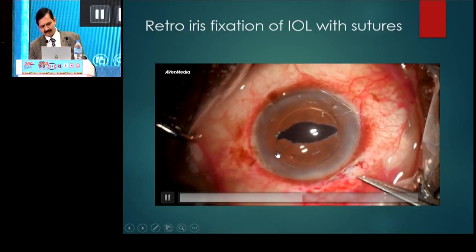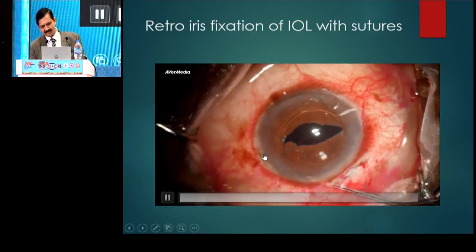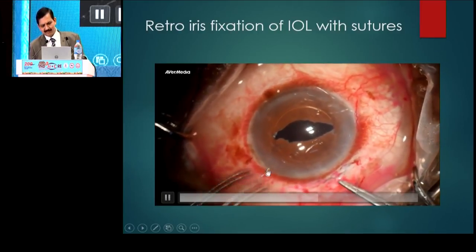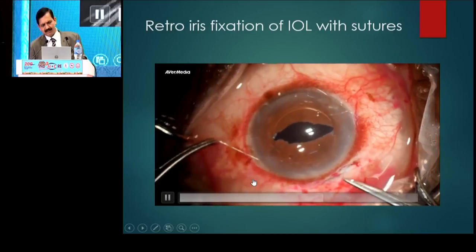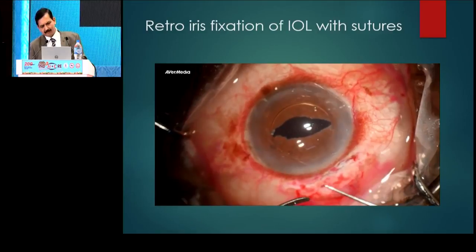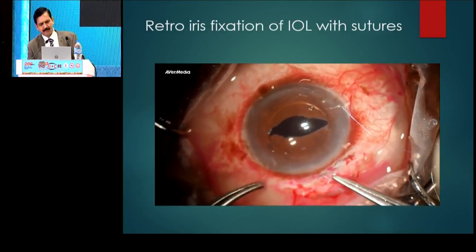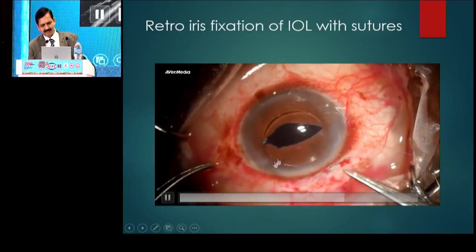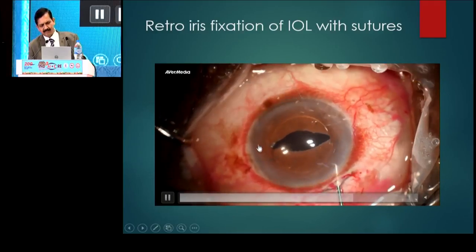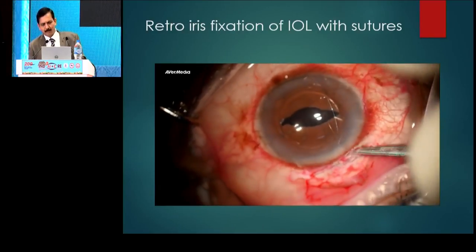Now a three clockwise knot is placed. As you pull this suture, the knot slips in. You don't have to take an instrument inside. The loop is taken again out and another single knot is placed. Like that, about three to four times you'll have to do it till you get a firm secure knot. You can see a fold on the IRIS at this place and the same thing is repeated on the other side. I am using 10-0 proline here.